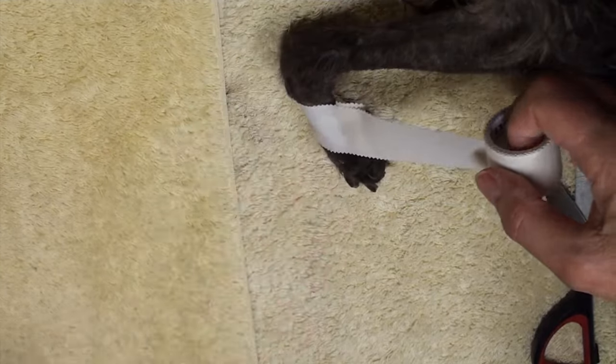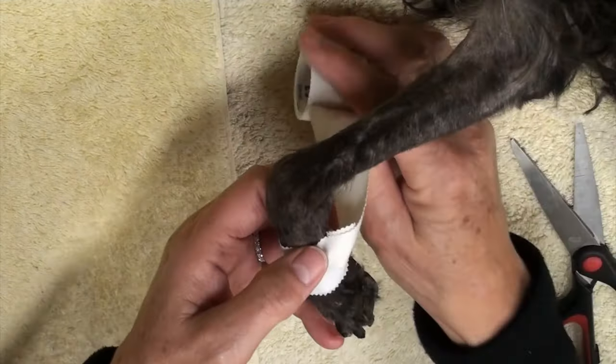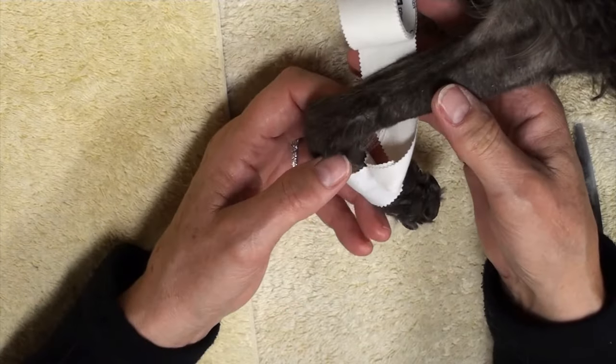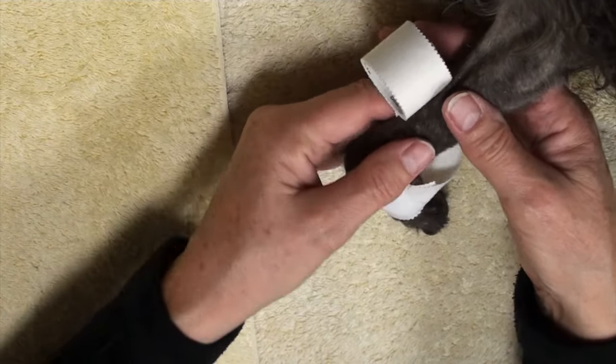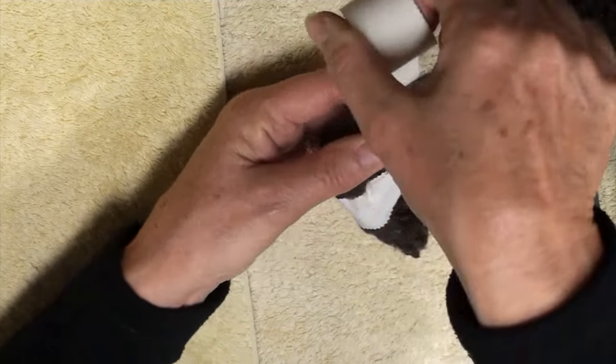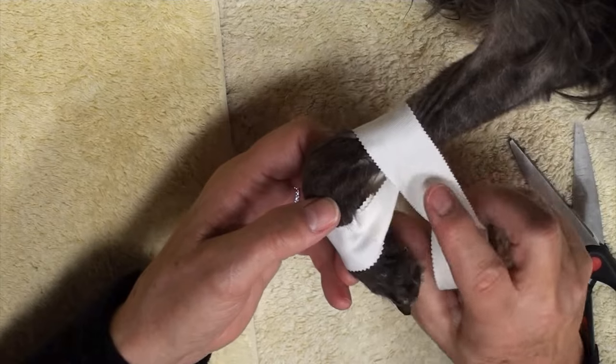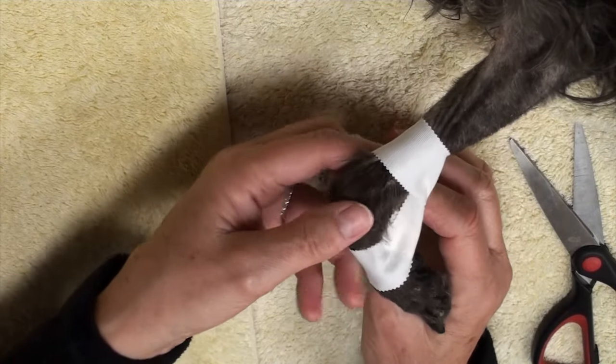Whenever I'm applying a sling, I like to make a loop with the tape rather than just wrapping the tape around the metacarpals. I create a loop with the tape. After that we're going to go up over the radius, placing the carpus in about a 90 degree angle.